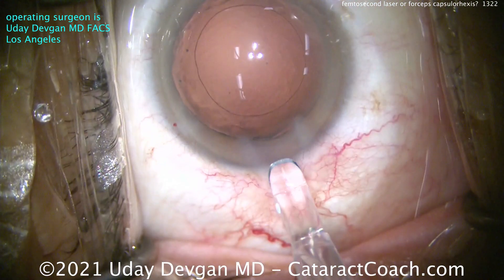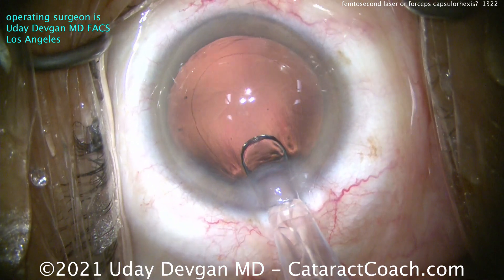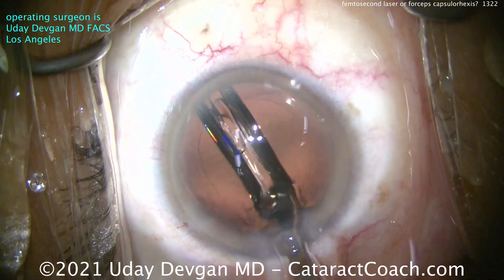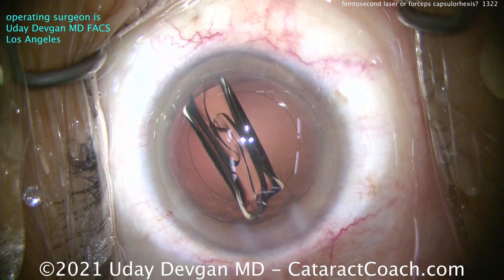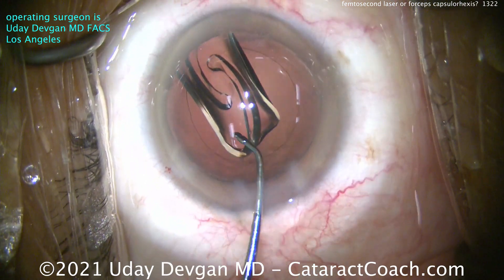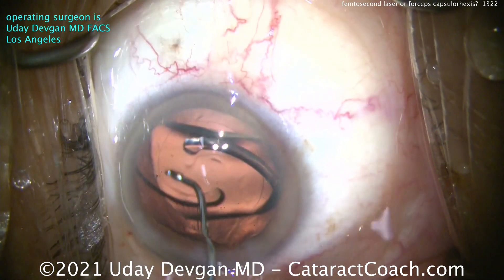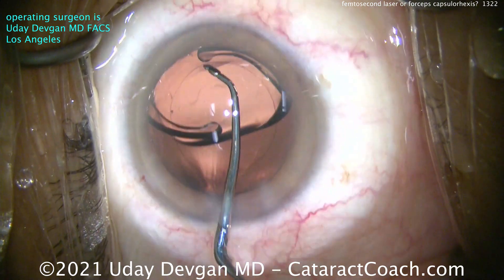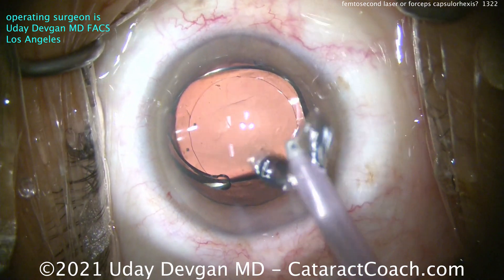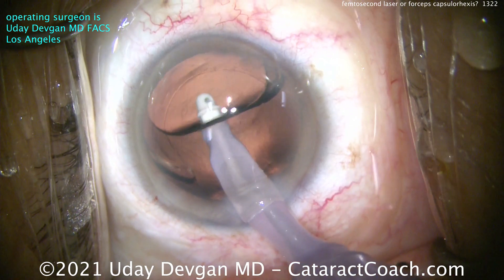So there's that round opening — a beautiful capsulorrhexis, it looks great. We're going to show you the lens insertion tube because that helps us measure the size. We know the optic of the lens is 6 millimeters. The reason we wanted that 5 to 5.5 millimeter capsulorrhexis was to overlap the optic edge to hold it in position. And you can see there's that 6 millimeter optic — an acrylic lens. As we remove the viscoelastic, you'll see this is a beautiful capsulorrhexis.